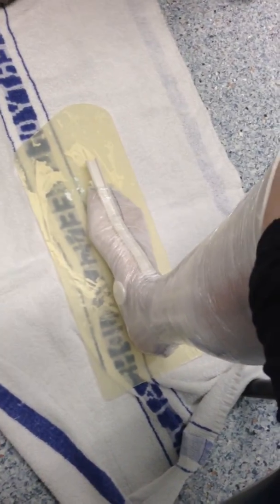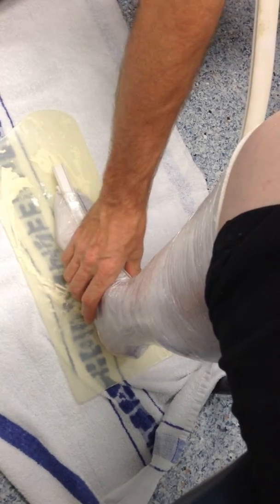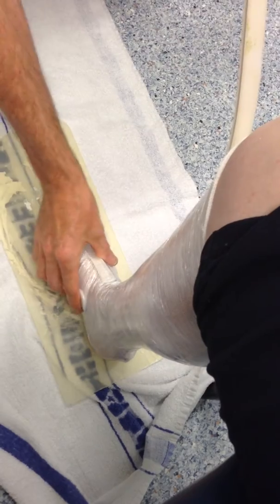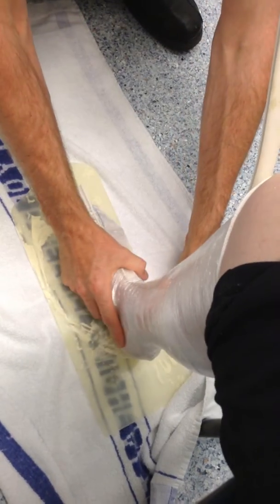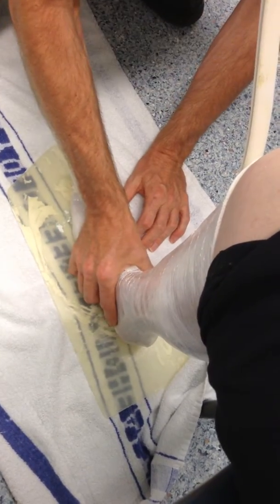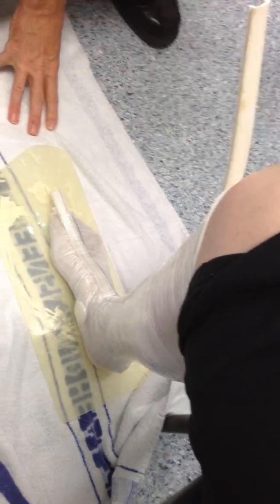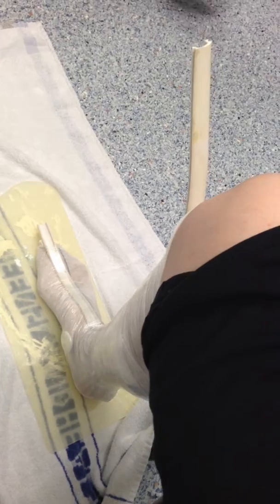The other thing is the feet — you know, when you're bending at the toes. I can only do that for a short time, as you get older. That looks pretty good. Put those in position. The next thing, we need a little bit of water. Might just move the foot over just a little bit, back just a touch. So that's the position we want now. We need a bit of water now.